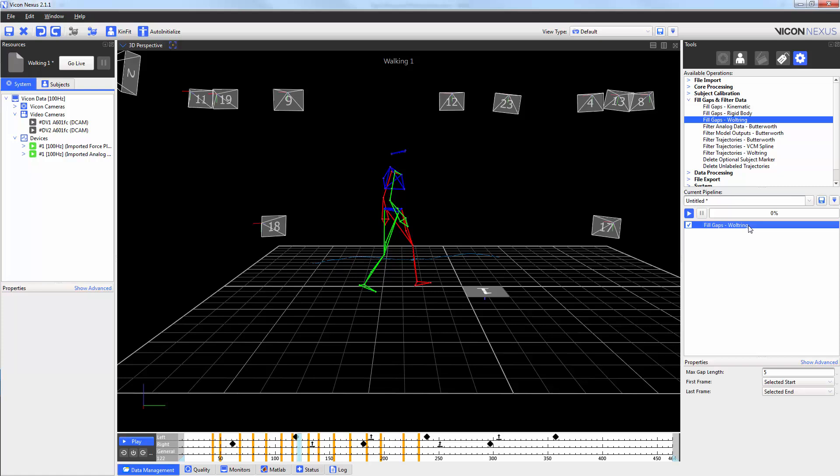As a general rule, the max gap length should be 5% of the sampling frequency. In this example, my sampling frequency is 100 Hz and so my max gap length is set to 5 frames.